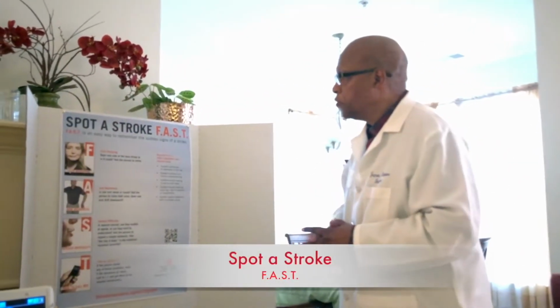And so that's one of the demonstrations I'm going to do today, is take a look at the carotid artery to show you what I look for to see if you're predisposed for having a stroke. And then also I'm going to do a demonstration of checking the circulation in the ankles, because it's very important to know how the circulation is moving throughout the whole body. So we check the carotid arteries, which are right here, and we also check the ankles to see if we get a good pulse down there. And that gives us an indication as to whether a person could possibly have a stroke in the future.